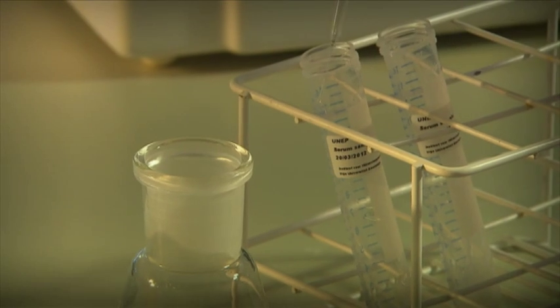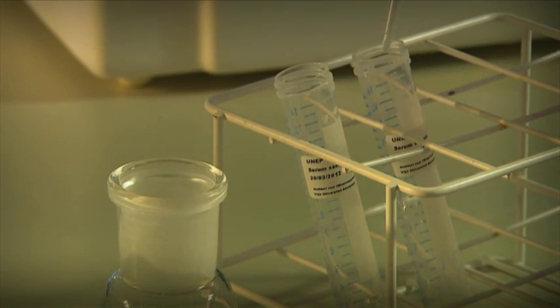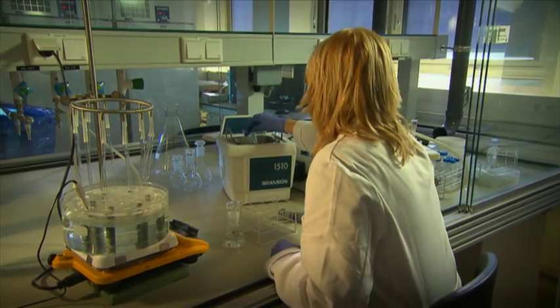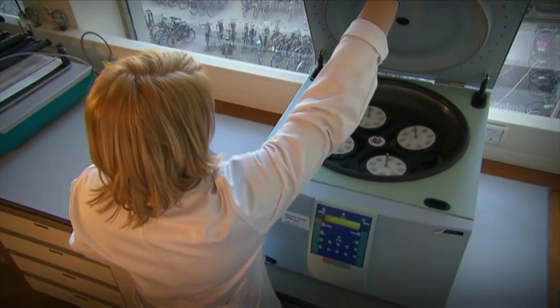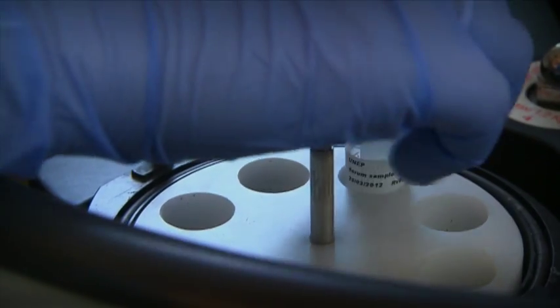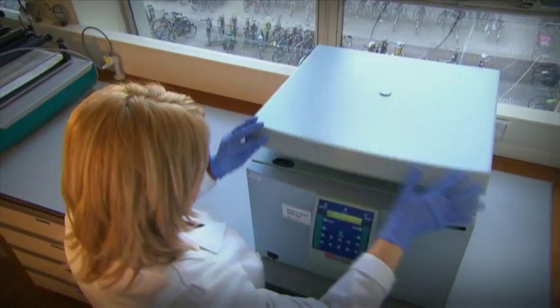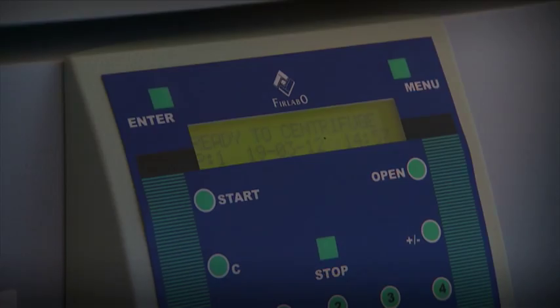We add 2 millilitres of 50% formic acid in water to the milk and serum samples and put them in an ultrasonic bath for 15 minutes. Then we put the extracts in a centrifuge at 3000 revolutions per minute for another 15 minutes, after which we do a solid phase extraction or SPE cleanup.